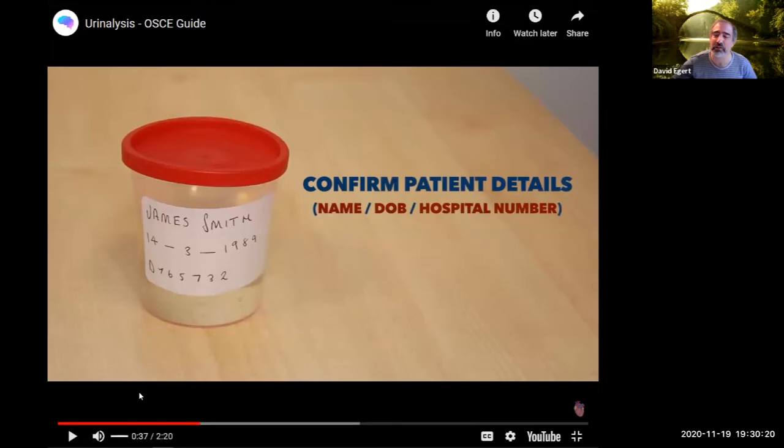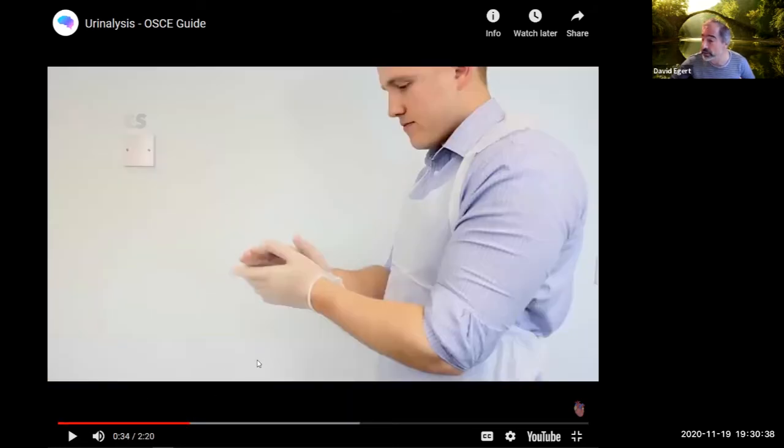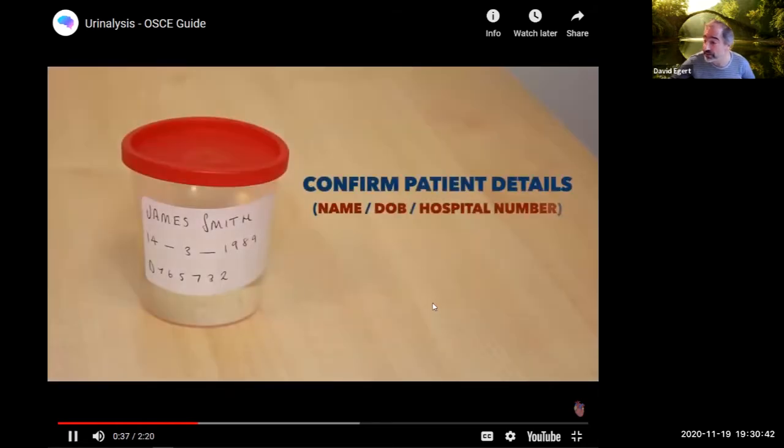In general, you don't have to be as paranoid about urine as you do with blood. Blood is definitely something you've got to be super careful about. Urine tends to be a little more sterile. Obviously, this guy doesn't want to get pee on him.